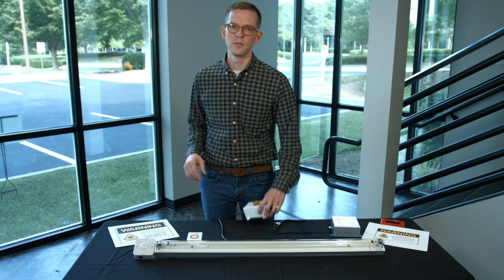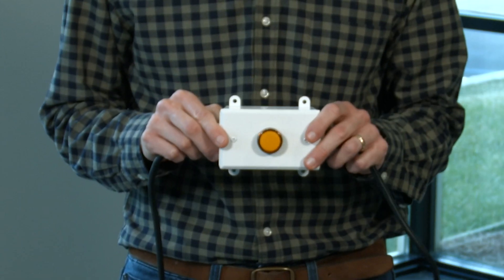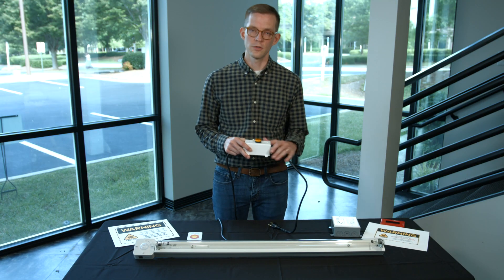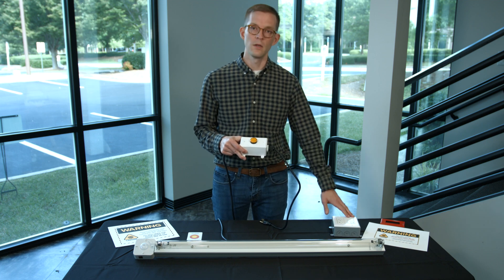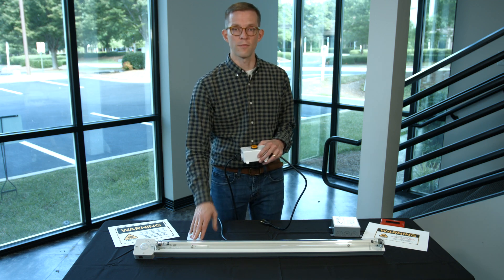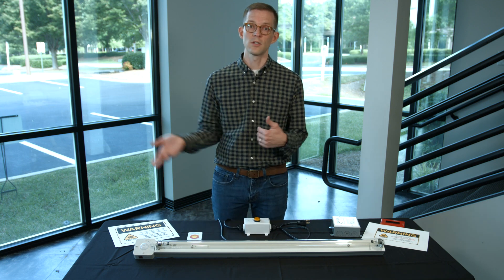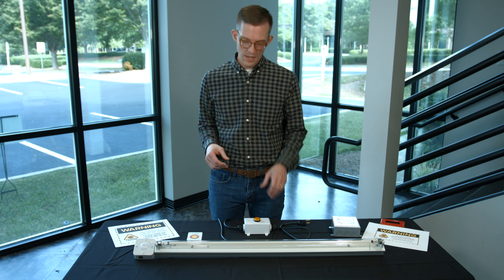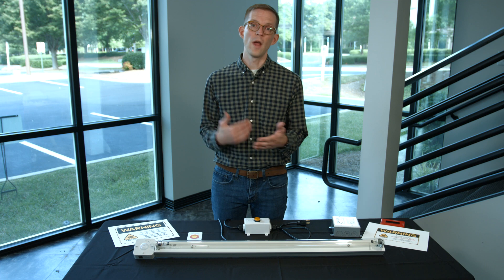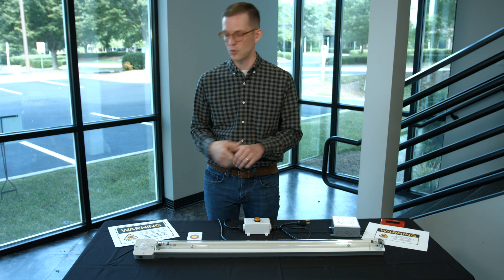Another installation tool worth considering is an indicator light, which I have here. This can be wired in-line between the switch controls and the fixture itself. It's a great idea to mount this outside the room where the disinfection cycle is running, so you have a very clear visual indication when disinfection light is operating and it's clear not to open the door.